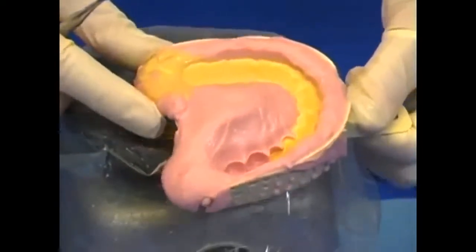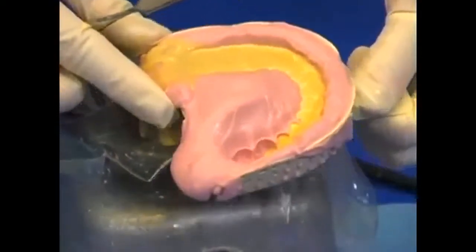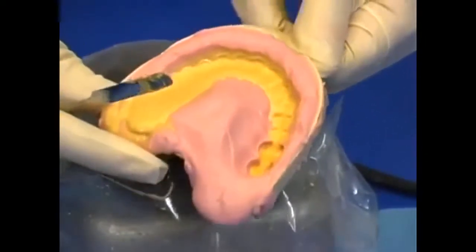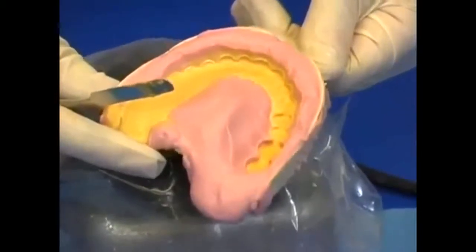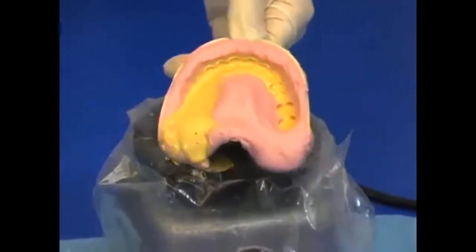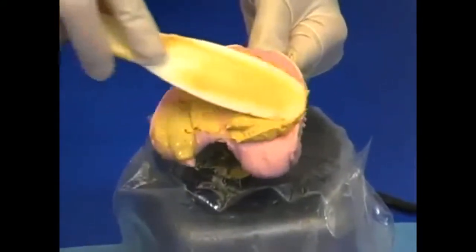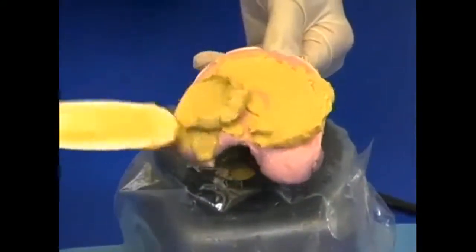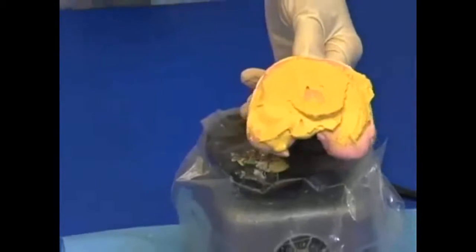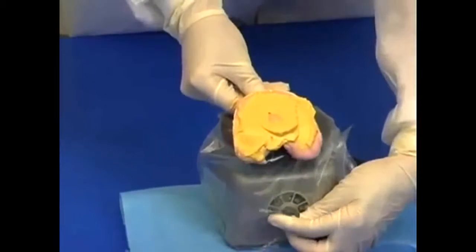Tilt the impression toward the opposite posterior end and continue adding stone until the flow reaches the other end of the impression. When all the tooth indentations are filled with stone, lift off the vibrator and begin adding larger amounts of stone until the impression is filled to the top. Vibrate the entire tray for 2 to 3 seconds to settle the material.